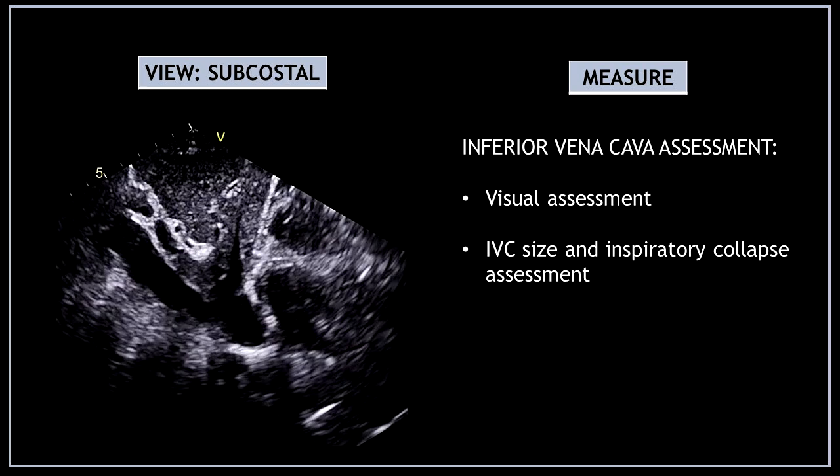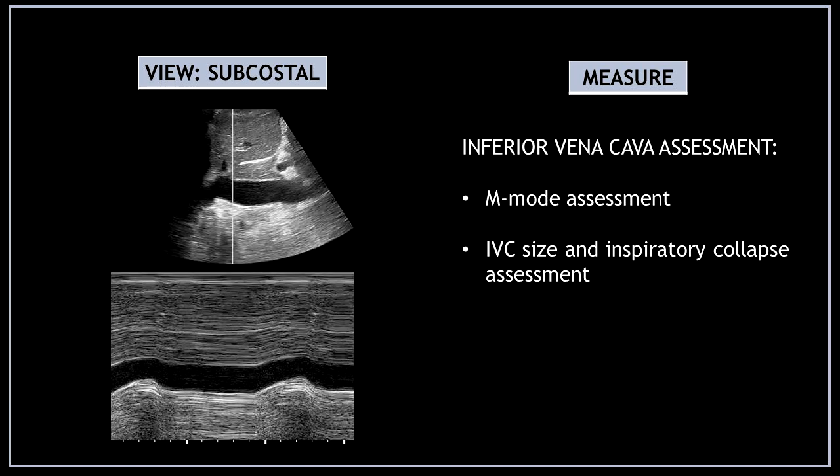Next, rotate the transducer in the same subcostal view to find the inferior vena cava and perform an inferior vena cava assessment. Visually assess the inferior vena cava, measure its size, and perform an inspiratory collapse assessment. In this view you can also use M-mode to assess the inferior vena cava size and the inspiratory collapse.